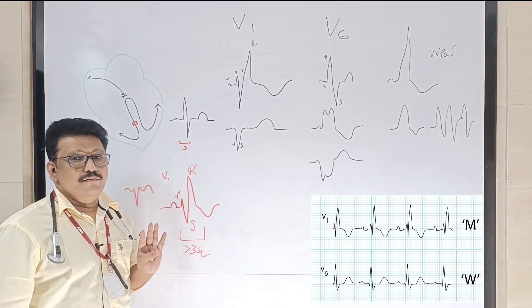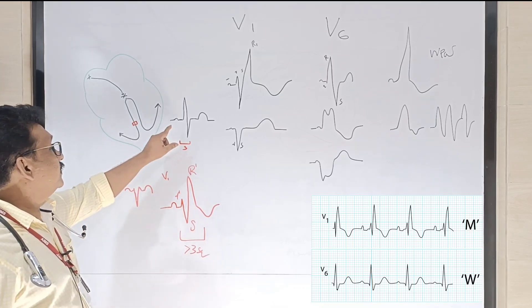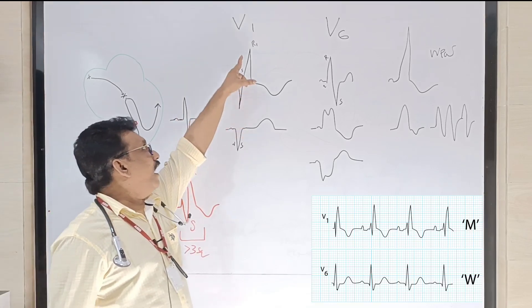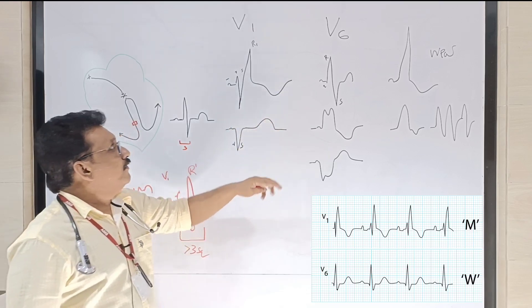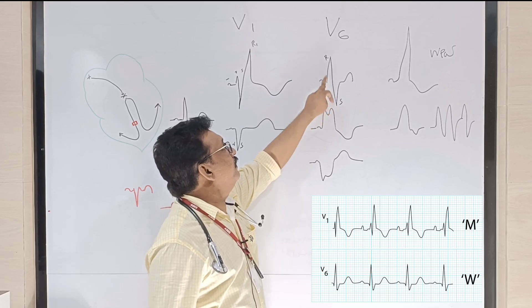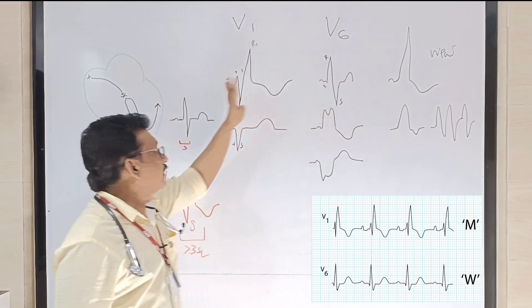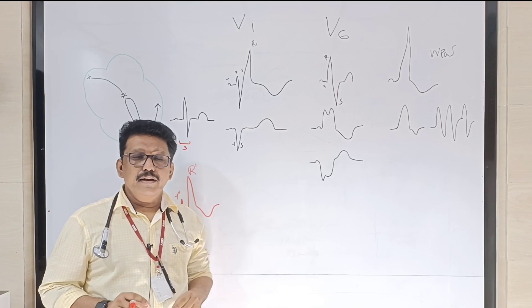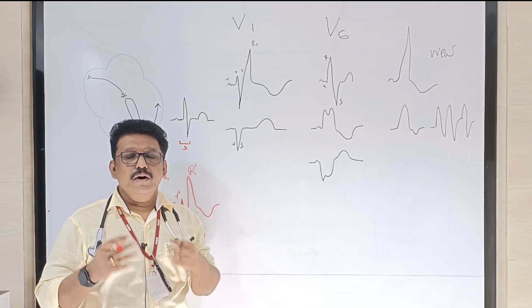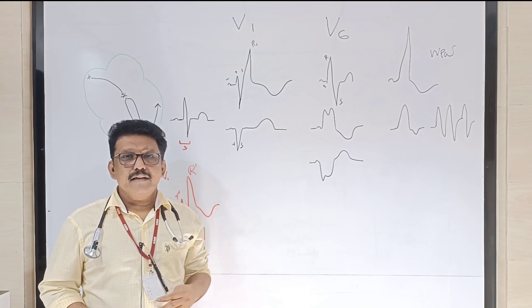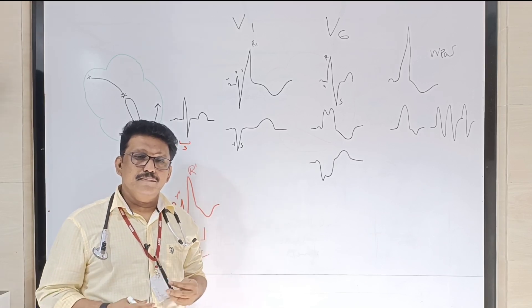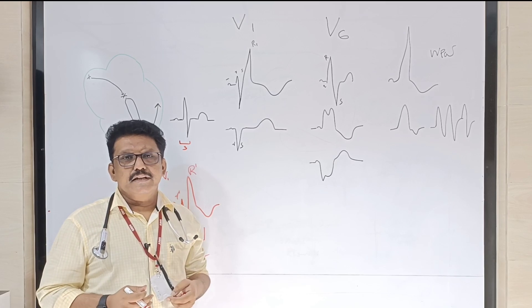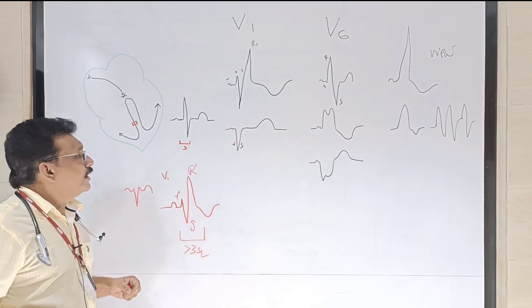Following the wide QRS, you see ST depression and T-wave inversion in V1. In V6 leads, you can see a small Q wave, an R wave, then an S wave — this is a typical pattern of RBBB. If the patient is absolutely normal with RBBB, no need to worry — it's a normal phenomenon. But if the patient is having clinical features of pulmonary embolism like chest pain, breathlessness, or DVT, then it may be a significant problem.